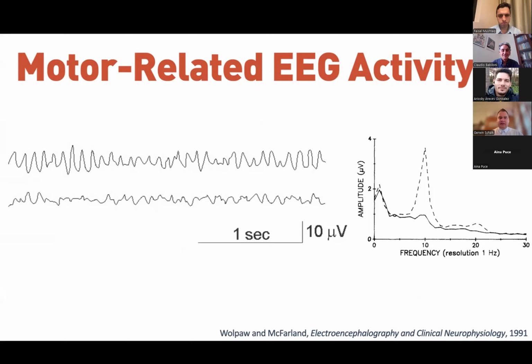the FFT, the way it works, is based on sinusoids. So it assumes that the signal is sinusoidal, which we know it isn't. So that has a lot of consequences. There are the peaks in the spectrum that we see, like around 10 hertz, but there may be other peaks at other frequencies that are really only there because the signal is not sinusoidal. And so the FFT shows us something at other frequencies so that it can describe the signal altogether. So this is really very problematic.